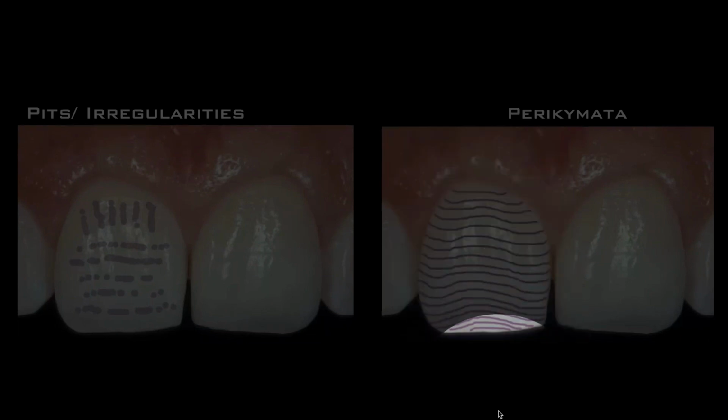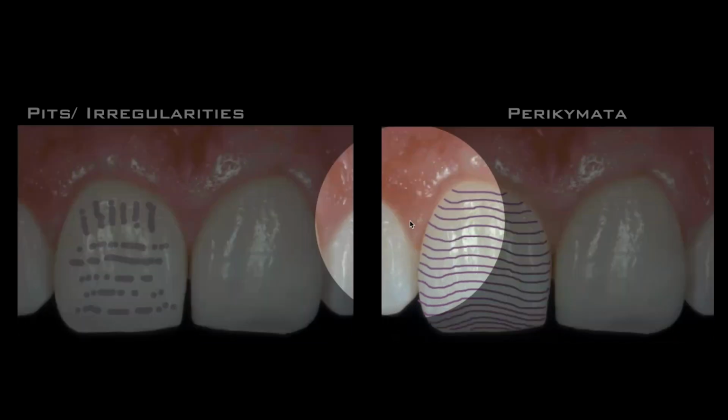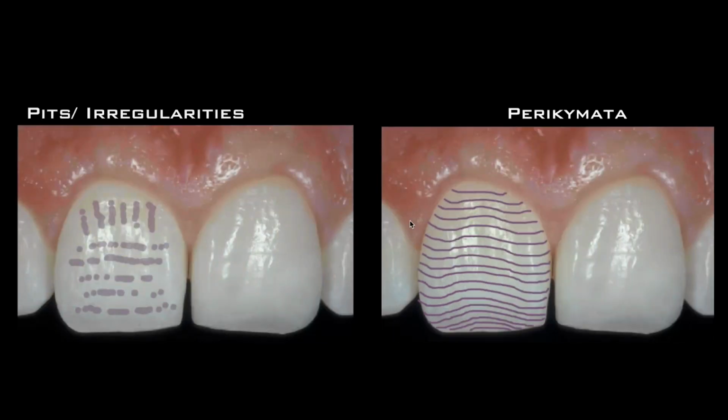If I just make that little U or C shape, and then every step after that I follow it, I follow it that way, I follow it that way, and you really start to create what nature would have done in the perikymata of the tooth. Now, would I leave it that way? Maybe, maybe not. It really depends on the age of the tooth. I might rubber wheel some of it away. I might lose some of it in the glazing process, which we'll also touch on.